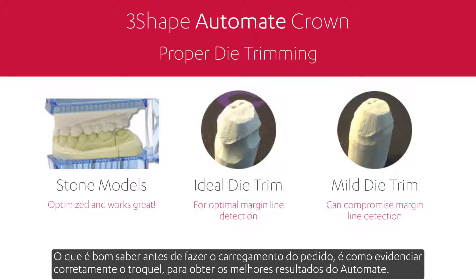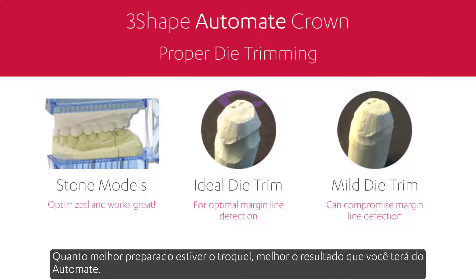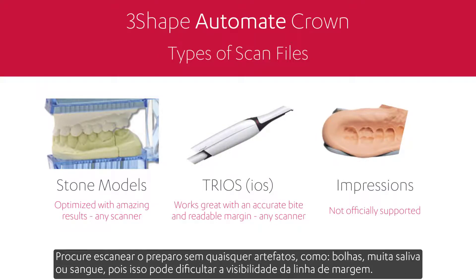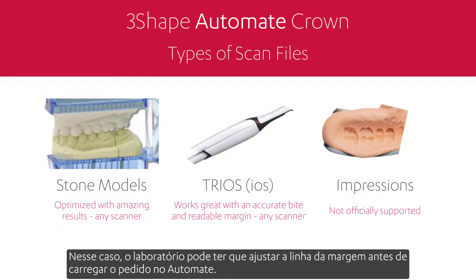What is good to know before uploading the order is how to properly trim the die to get the best results from Automate. The better the die is prepared, the better result you'll get. This is applicable for gypsum cases as well as intraoral scans. Keep in mind to scan the preparation without any artifacts like bubbles, too much saliva, or blood, as this may cause a lack of visibility of the margin line. In that case, the lab might need to set the margin line before uploading the order into Automate.